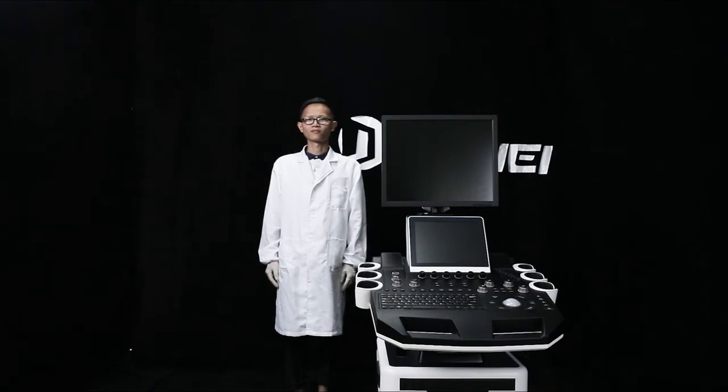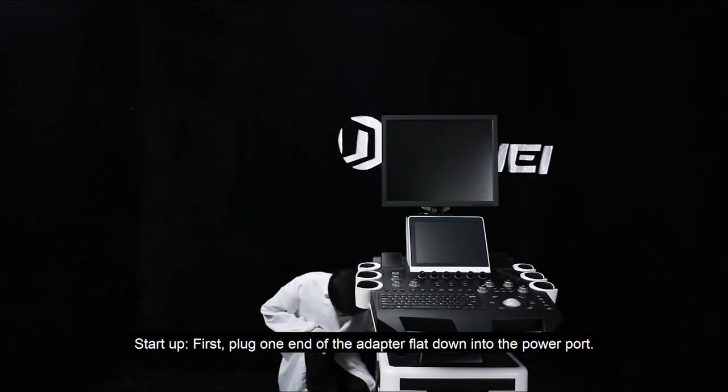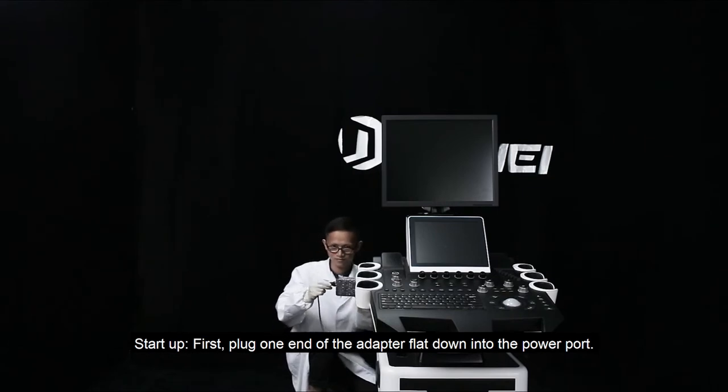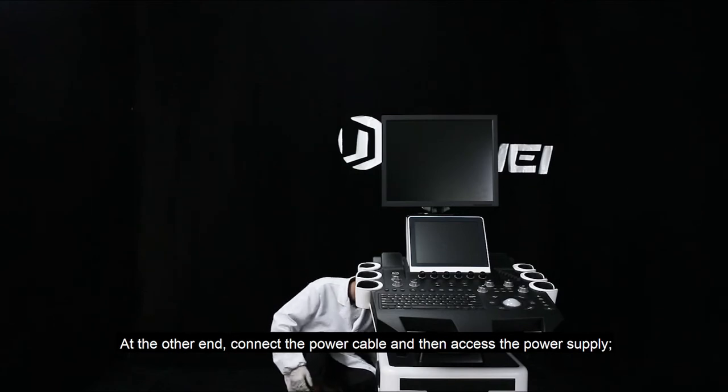Introduction of starting up and shutting down the machine. Start up. First, plug one end of the adapter flat down into the power port. At the other end, connect the power cable and then access the power supply.